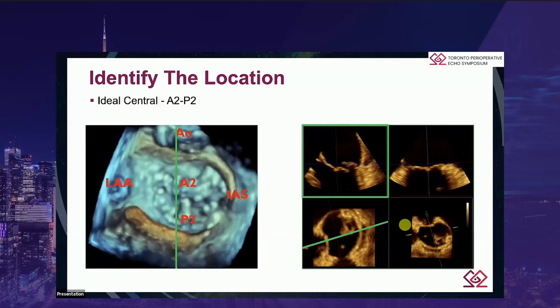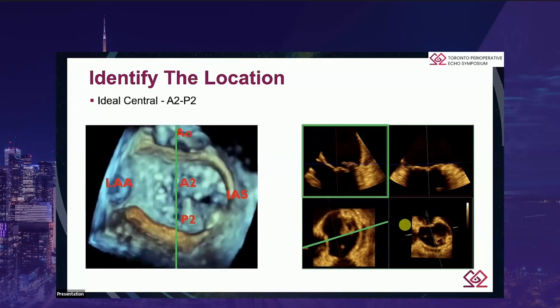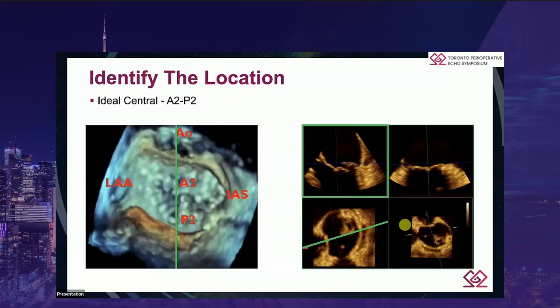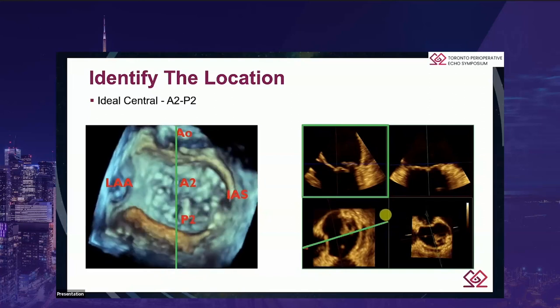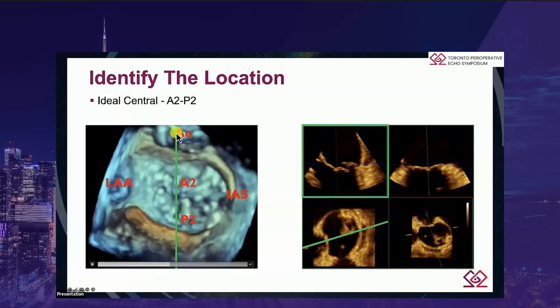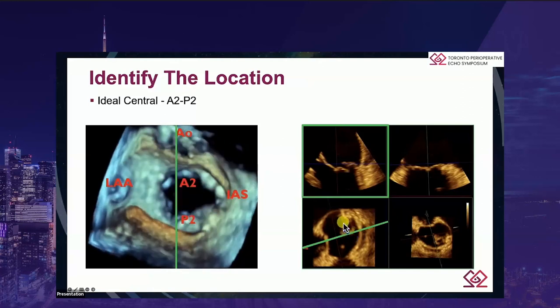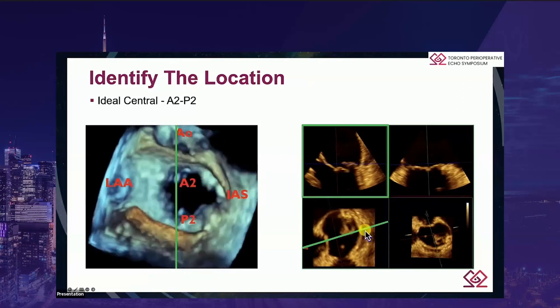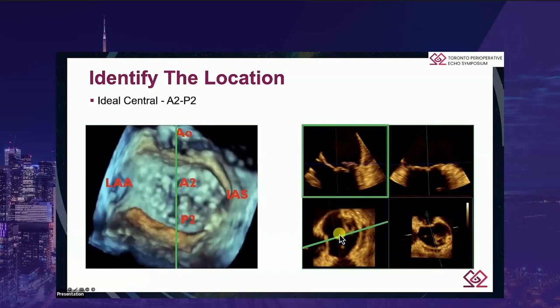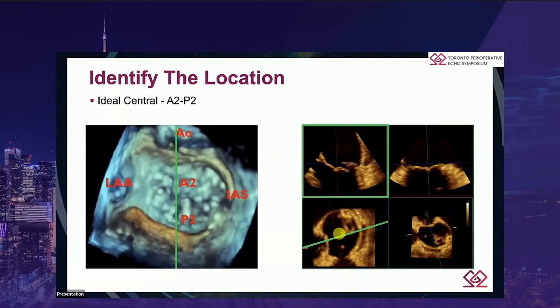Once you've identified the mechanism and quantified the severity, the next step is to identify the location. Using MPRs, we create our green plane straight down the middle of the valve. You can see that, yes, it is a P2 flail, but it's actually a P2 medial. Using MPRs, you can increase your accuracy and focus your target location in the precisely desired location for optimal results.